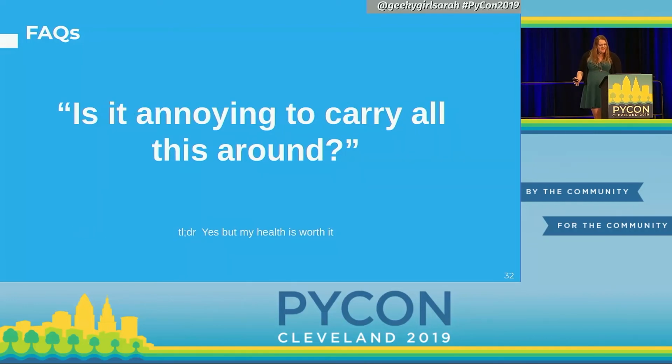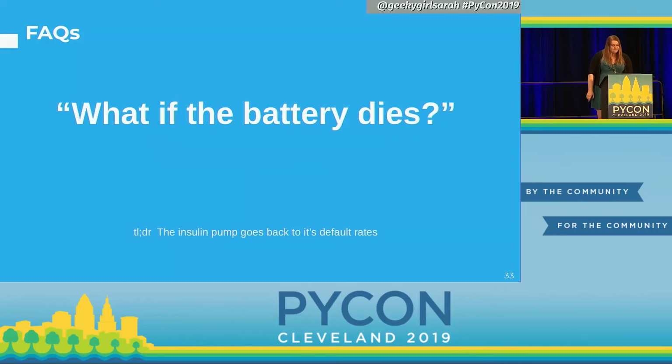Is it kind of annoying to carry all this stuff around? Sure, I mean, I have to either carry it in my backpack or attach it to a purse or a belt loop or something like that, so it's a little bit annoying. Because I've been gone for a few days at a conference, these are all my spare insulin pump supplies, extra insulin, CGM things, a whole bunch of nonsense. So that's a little bit annoying, but my health is so much better because of this. It's managing a lot of things I don't have to do anymore, which is really great.